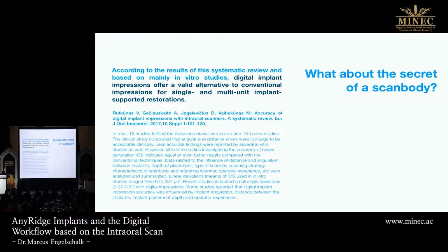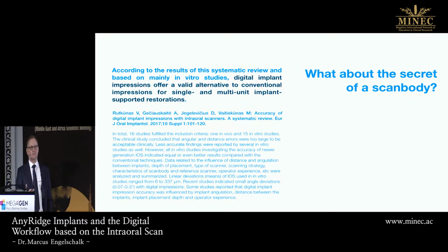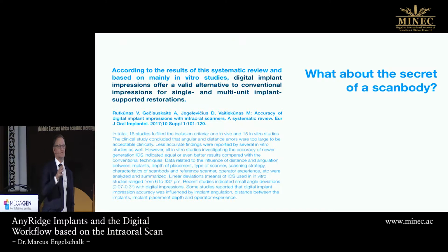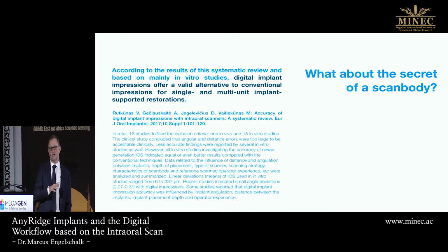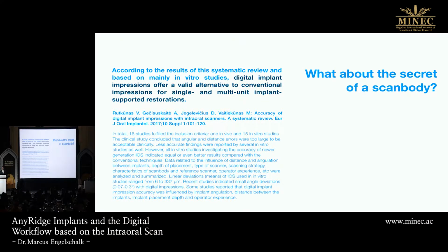The first thing is, you can see I highlighted a little bit, the digital impression offers a valid alternative to conventional impressions for single and multi-unit implant-supported restorations. So after this study, we know, or there are a lot of studies, we can use it, because intraoral scanners on teeth, on crowns, inlays, bridges are proven very well. Just remind the CEREC system, it's very common to use now. But implantology is a little bit different.